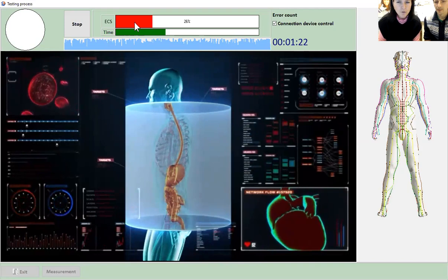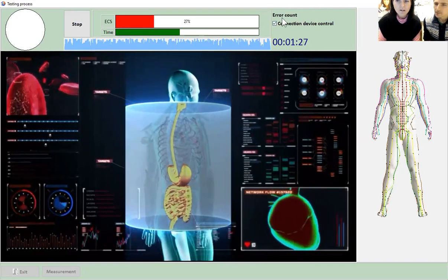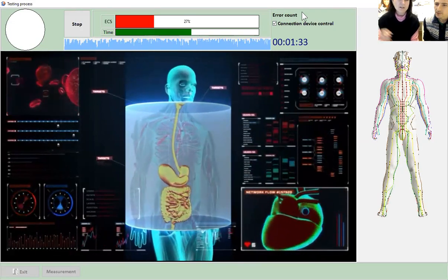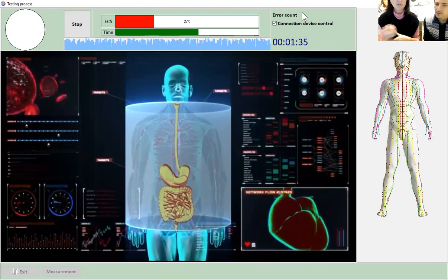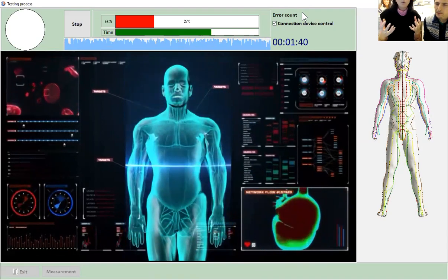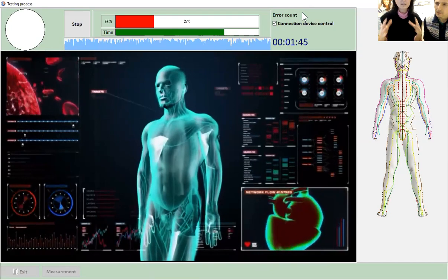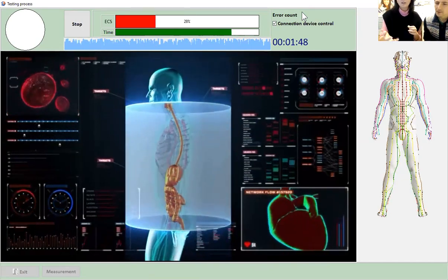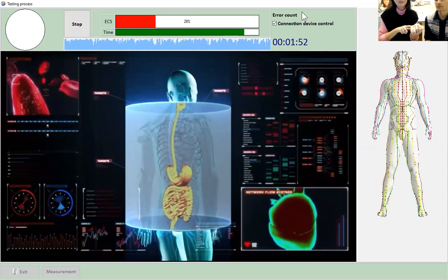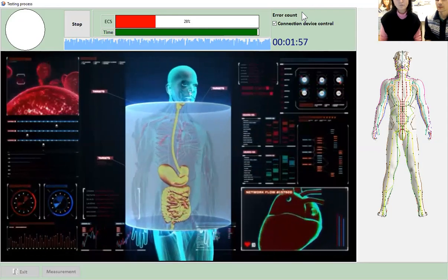And as I said before also, if it starts to be 1-2%, it will start an error count. So there will be numbers here. And after like 10 error counts, it will shut down, so the person cannot be measured. If the person has just run or was stressed, let the person take a rest. But otherwise, sometimes just try other points, MC6 or 5. It also can give a better connection.